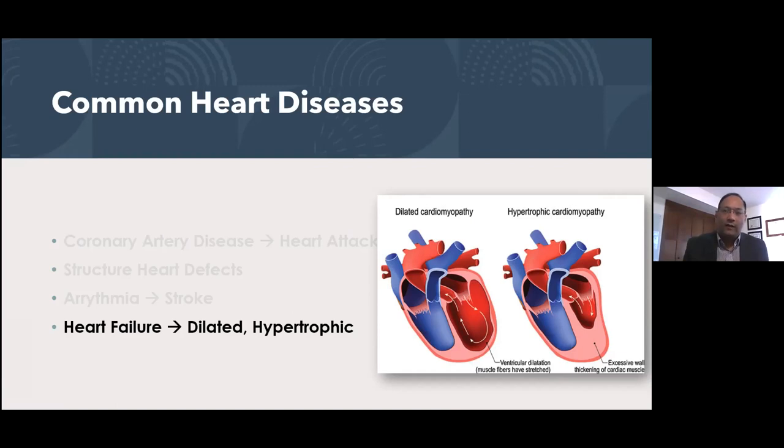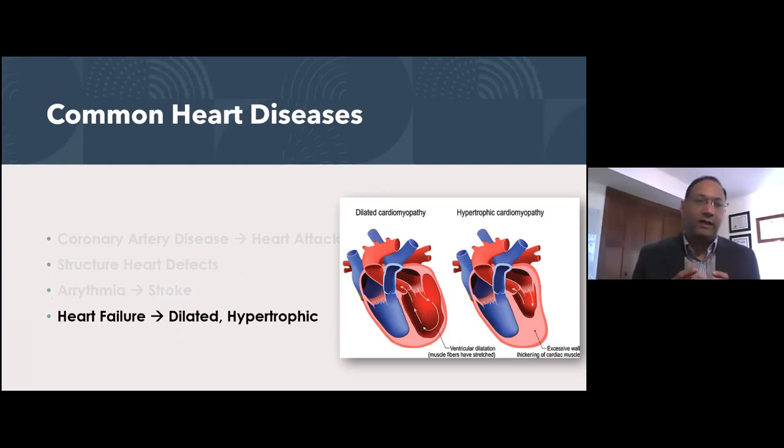So LVAD is a mechanical device that was mostly used when patients are in hospital. But nowadays, you can actually have an LVAD device and then go home. Imagine a device that is put around the heart that can compress the left side of the heart, and it assists in terms of the mechanical function, when the tissues are not well, when the electrical function of the heart is not going well.